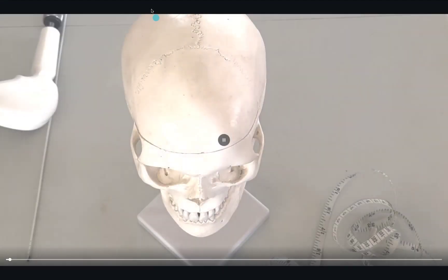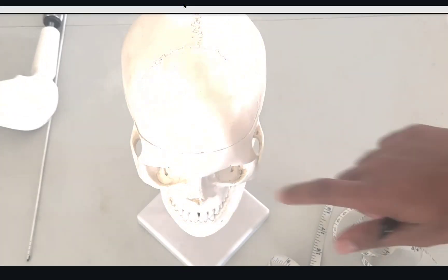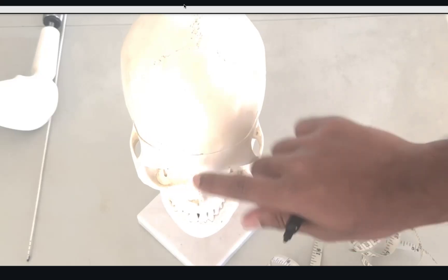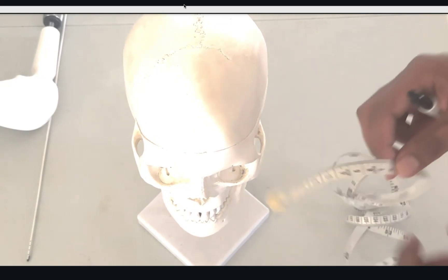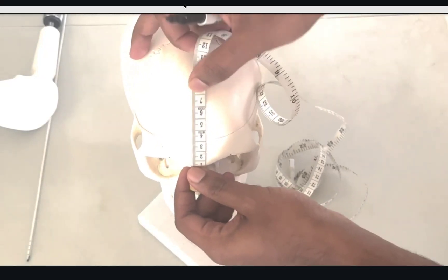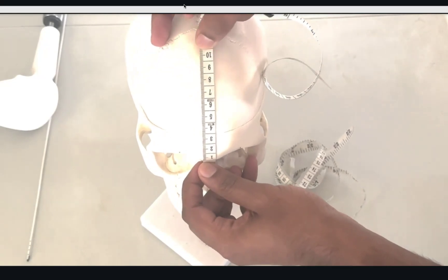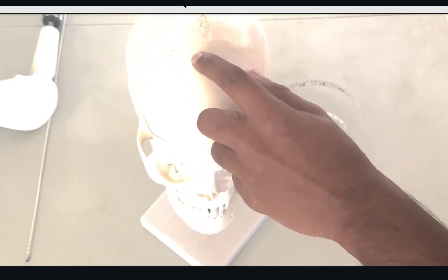We'll walk through the landmarks of the skull and where to insert the EVD. We start off by identifying the most prominent point, the nasion, and we're going to travel 11 centimeters back. Of course, you'll use a sterile marker in reality to mark out the 11 centimeters.